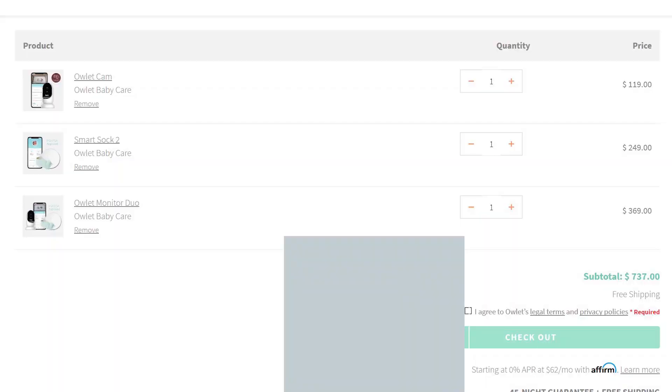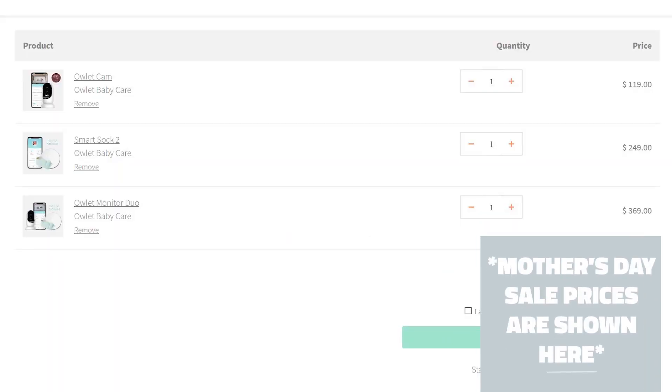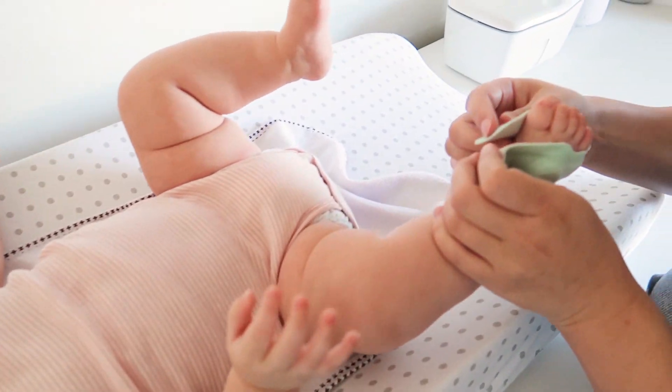It will alarm you if something goes outside of normal range. The cost of both the camera and sock together is $450. The sock alone is $300 or the camera alone is $150, which is pretty expensive. We initially decided not to get the smart sock because of the cost, but then we found out it is HSA and FSA approved, so we were able to use our HSA account. They also offer payment plans.